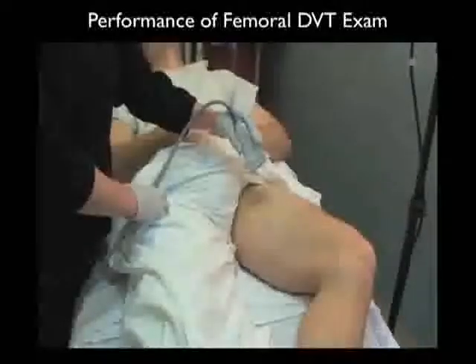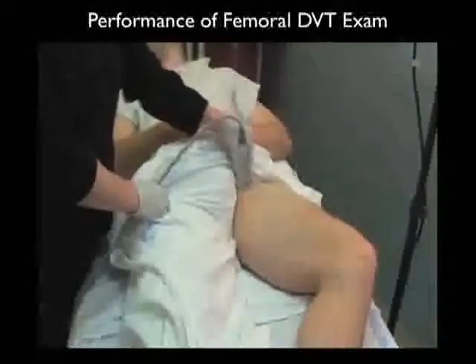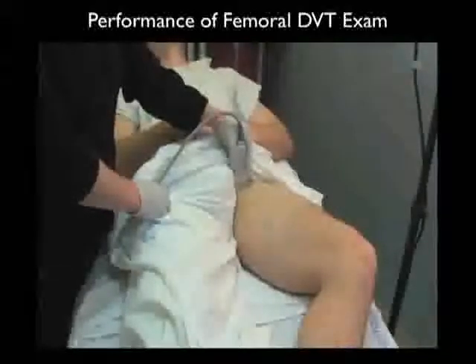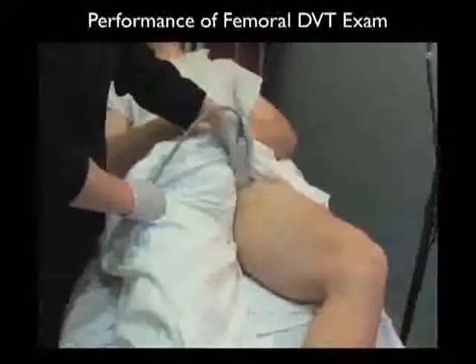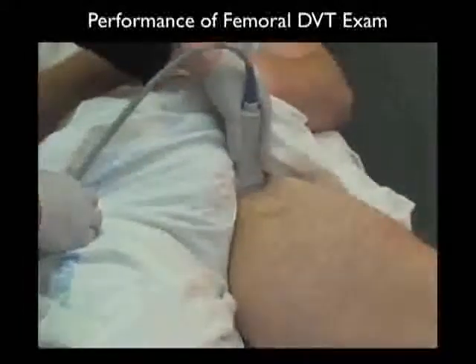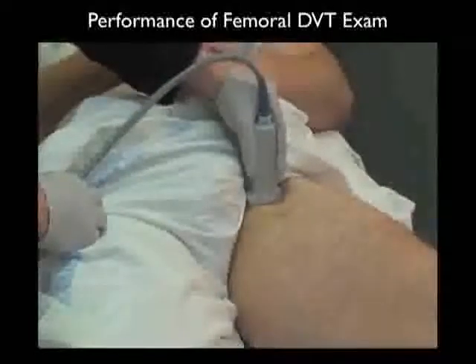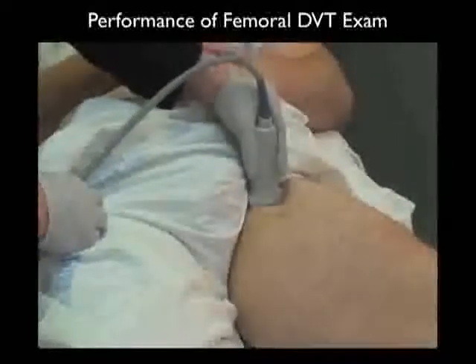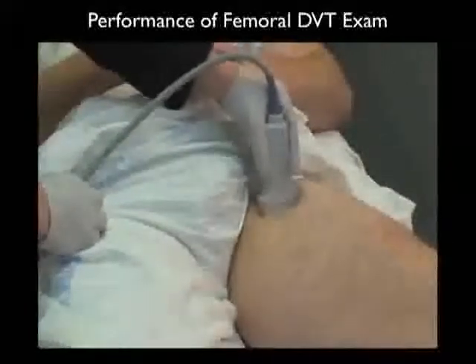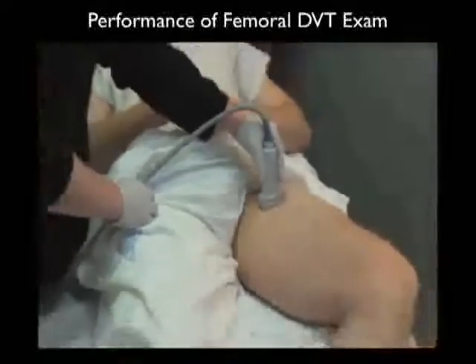Let's now watch a video and learn how to perform the ultrasound examination looking for DVT within the femoral vein system. We begin by placing the high-frequency linear array type probe. It's the same probe that you'll be using for vascular access in a side-to-side orientation over the common femoral vein and artery just below the inguinal ligament. Notice that we're compressing down with the probe, and essentially the DVT exam is a compression exam, as a normal vein will completely close with pressure down with the probe.